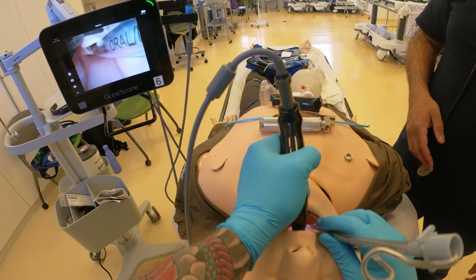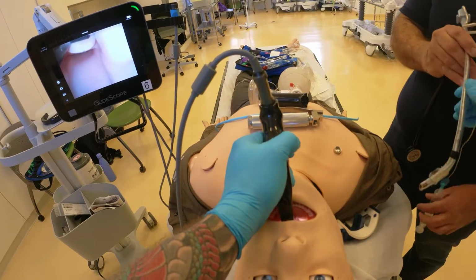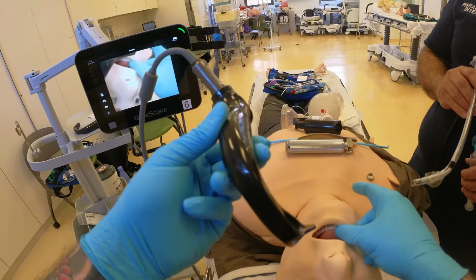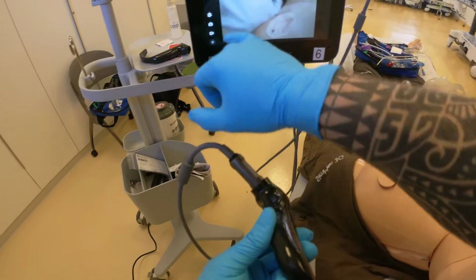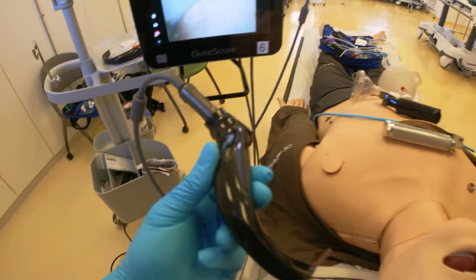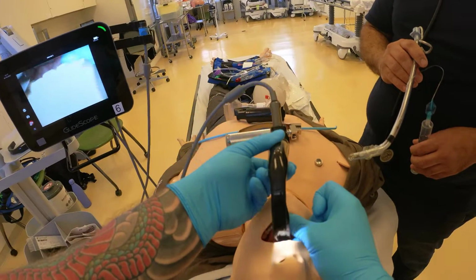So for this device, the hyperangulated blade, let me just show you the entire procedure. So you're going to hold my tube. The entire procedure is this: two fingers, thumb, cross finger technique on the mouth. And this device actually allows me to record, and I'm going to record it. I'm going to post this as well. I'm going to record this on the video. Perfect. So cross finger technique, coming straight forward.